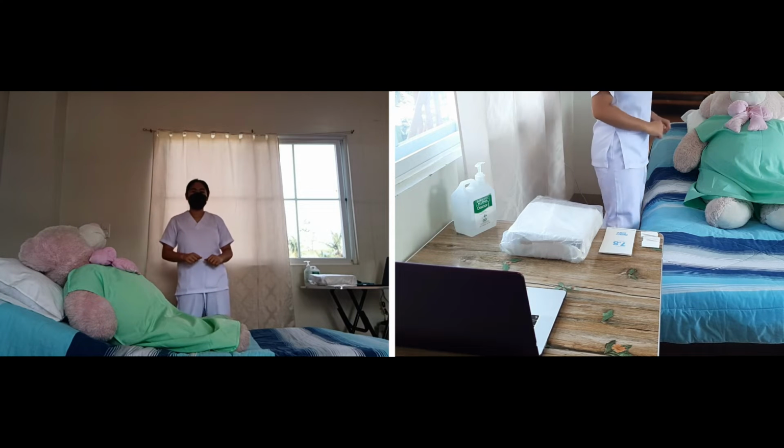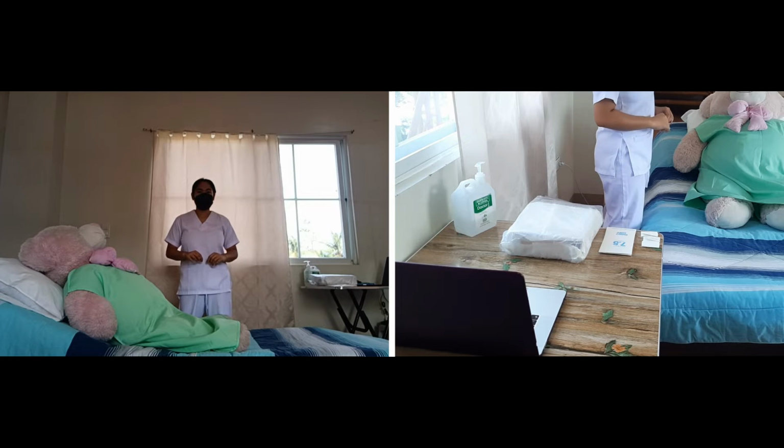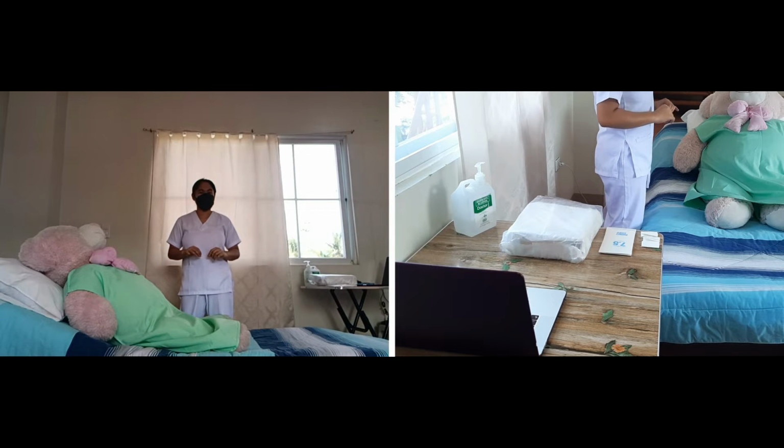Hello everyone, my name is Stella Martinez, and for today I am going to perform the proper way of inserting a Foley catheter onto male patients. So first, what is the purpose of male catheterization?